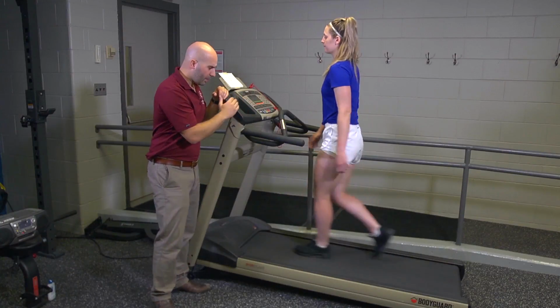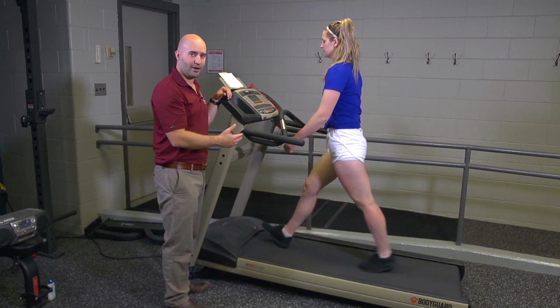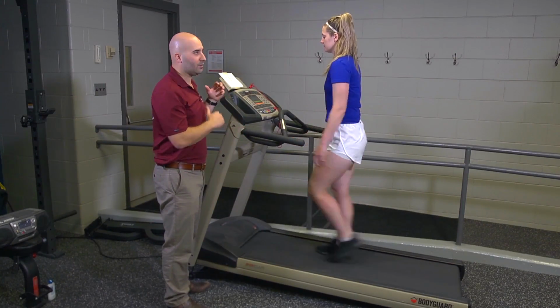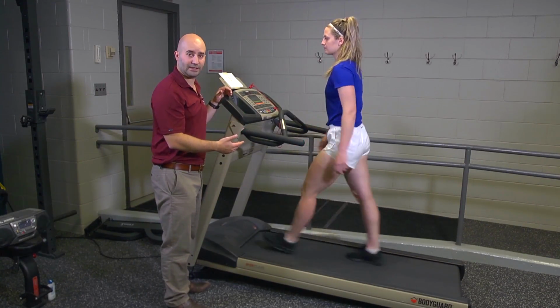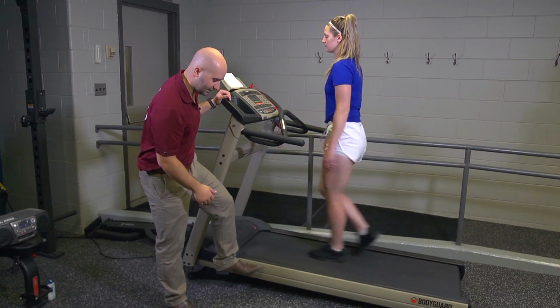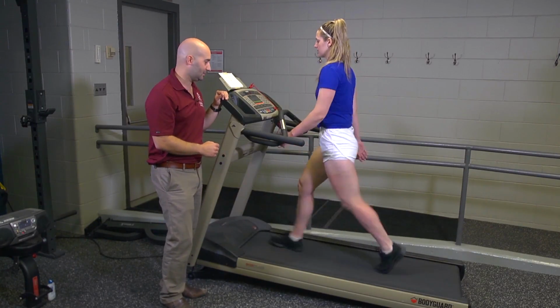Now, let's assume she's done her other 4 minutes and it's time to cool down. How do we get our client off the treadmill? Depending on the speed and the fatigue, it might be difficult for them to just immediately step off the rails. And probably what they want the most is to reduce this slope, because that's really going to be creating potentially some lactic acid in the calf muscles.